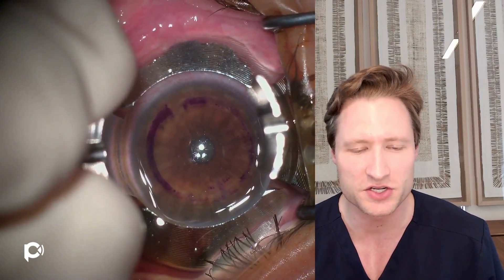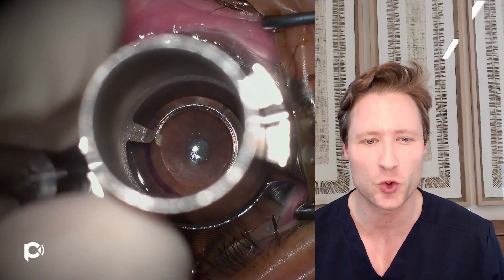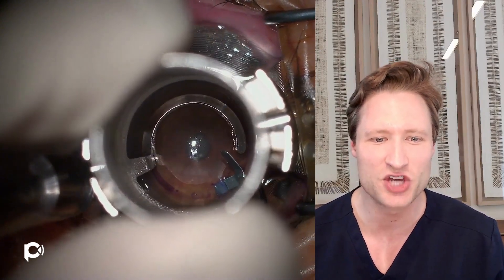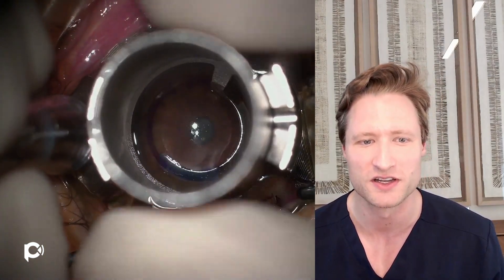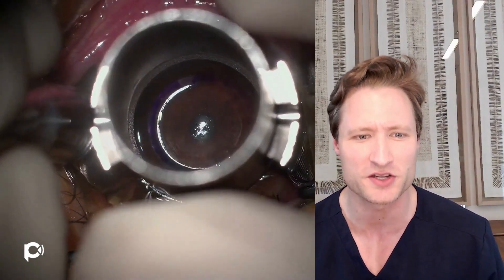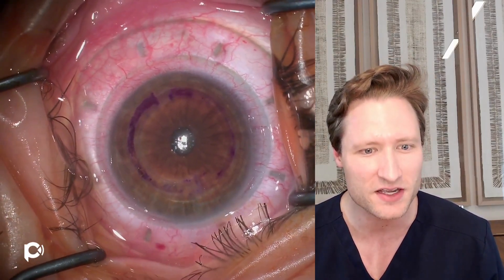With the suction still on, we're going to use our symmetric glide — colloquially known in our clinic as a shoehorn — to place this curved corkscrew dissector into that incision. The dissector is positioned adjacent to the incision, and we're sneaking it underneath this symmetric glide. As we turn it, it dissects this little channel in the recipient cornea. Now the symmetric glide is removed — it's only really needed just to start that pathway. So now we have the corkscrew dissector out and all of the basic cutting has been done.